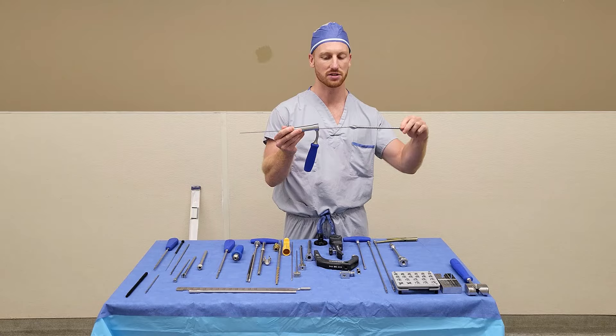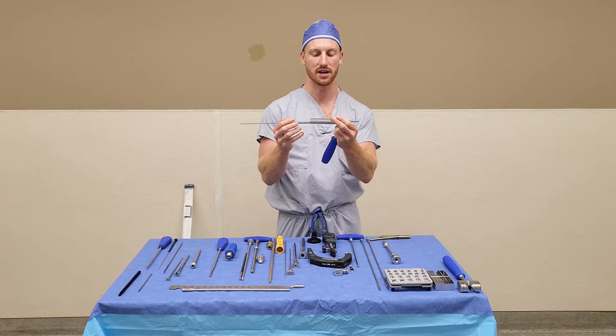And after that, you have your opening entry reamer, which is cannulated, so it will go over the guide wire and make the hole for the proximal portion of the nail.